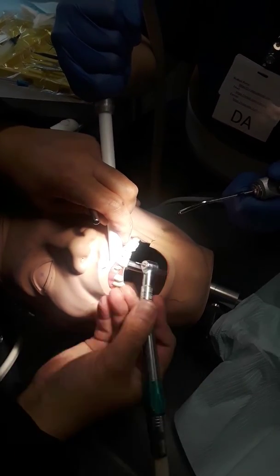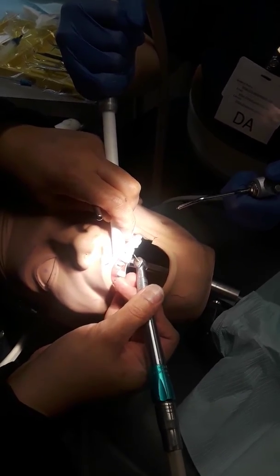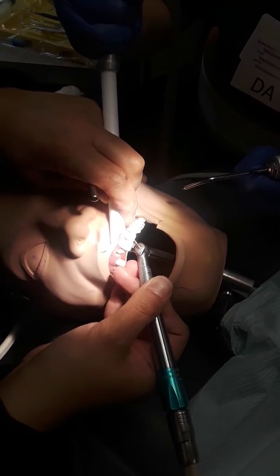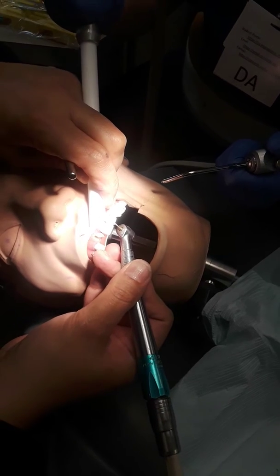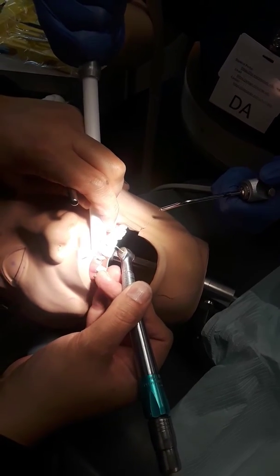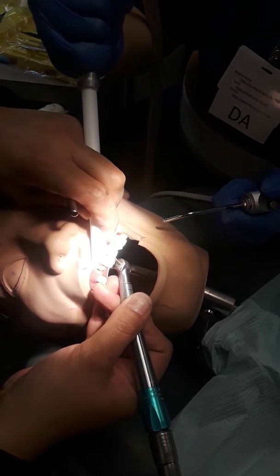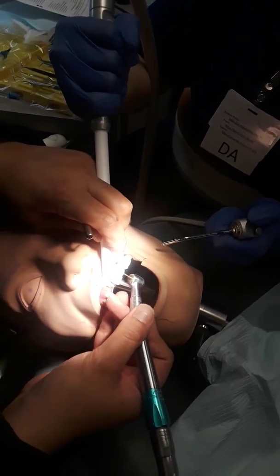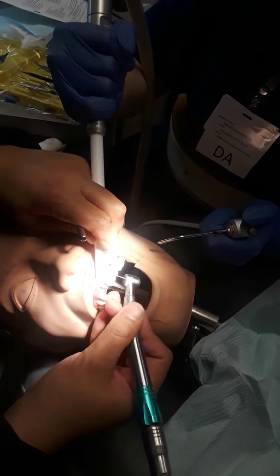Now I'm going to do my incisal edge. We can use a high speed with finishing burrs and diamond burrs for a temporary crown, but we cannot use any other burr because it'll cut the tooth.